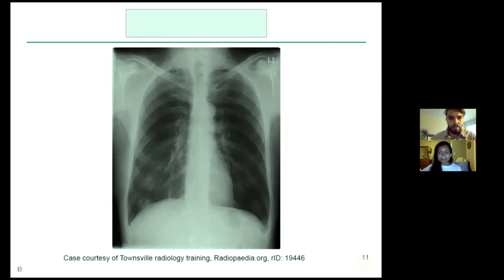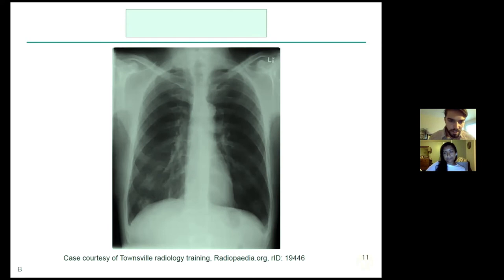No broken bones, and maybe a little bit more ribs than I normally see. Then sticking to C: normal cardiac border, maybe a little bit less than half the chest diameter. Looking at the diaphragms, making sure I'm not missing any free air under the diaphragms, and the costophrenic angles look sharp.